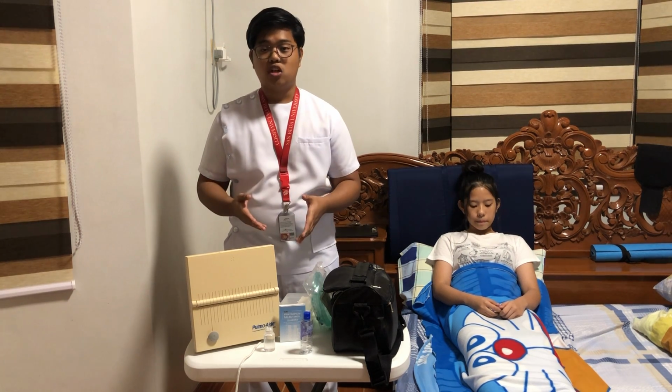Now that we're able to identify the patient, we're now going to explain the procedures to the patient, and we will also discuss to the patient the possible adverse reactions or potential adverse reactions and any other concerns related to our medication if it is her first time taking this kind of medication.